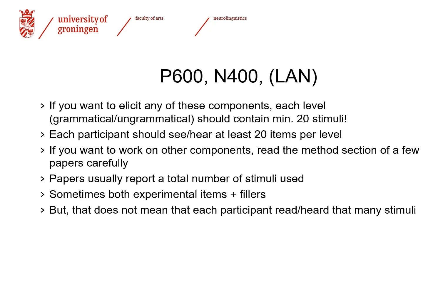In this case, what we are limited by is the nature of EEG data that we obtain. EEG data are quite noisy, meaning that they contain information that is not related to what we are interested in. In addition to containing the brain's electrical activity that is a response to our experiment, there is also electrical activity that has nothing to do with it and is coming from external sources or internal sources that we're not interested in. So due to the noisy data, we need to have as many stimuli as possible.